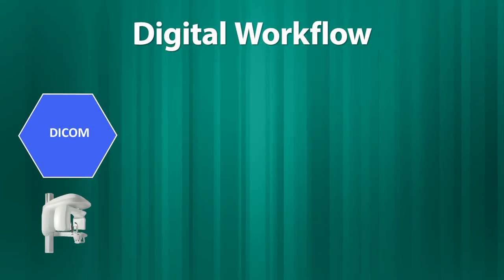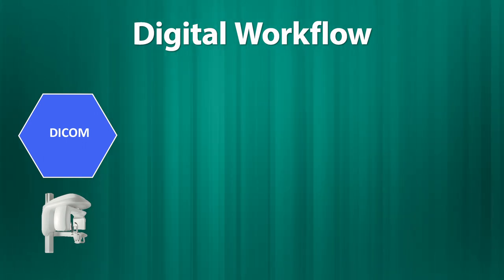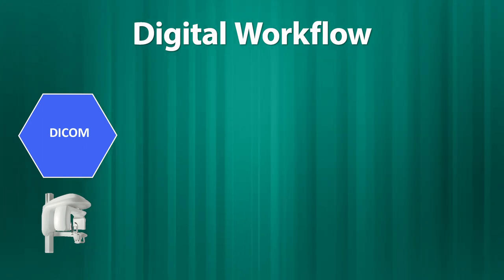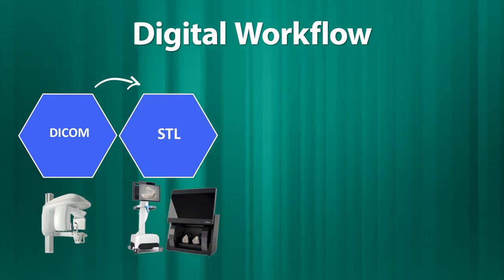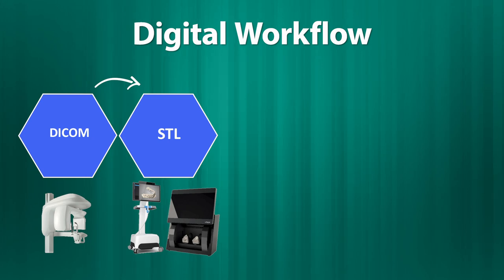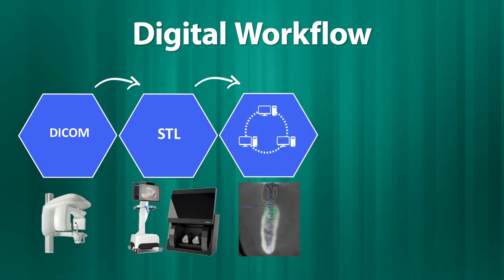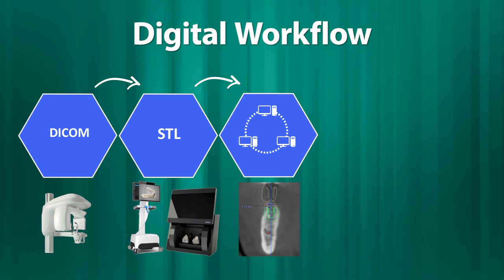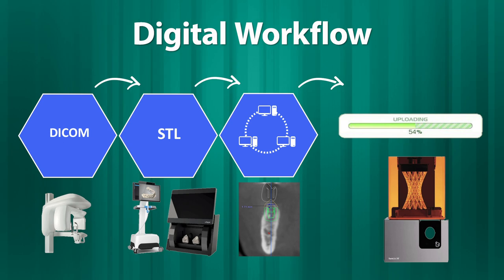The workflow begins by requesting a CBCT for the patients, which will result in having DICOM files, then optical scanning of the patients to obtain an STL file representing the 3D image of the intraoral structures, then virtual simulation of the treatment plan using implant planning software, which ends by designing and exporting the surgical guide for 3D printing.